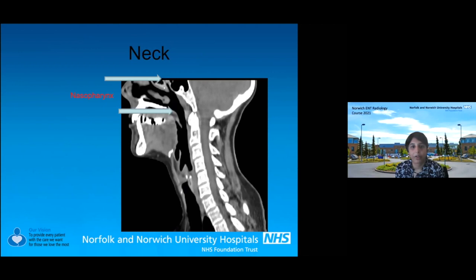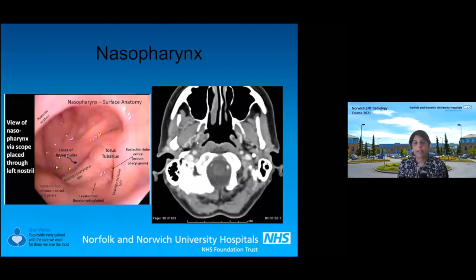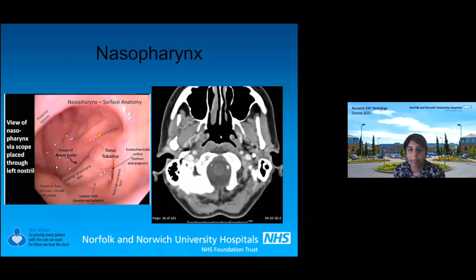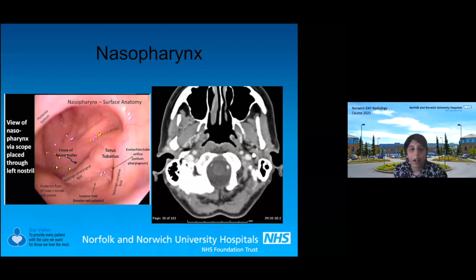This is the sagittal view, and this is an axial contrast soft tissue CT showing the nasopharynx. The nasopharynx on CT or MRI should always be filled with air — it should look black. There shouldn't really ever be anything in it.